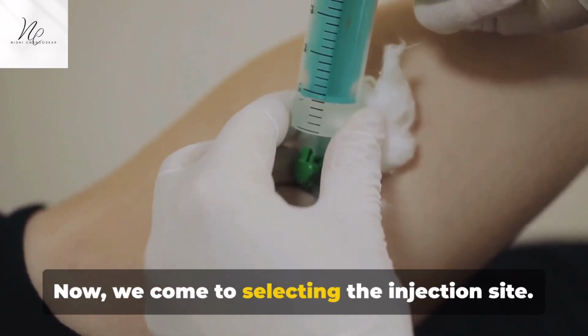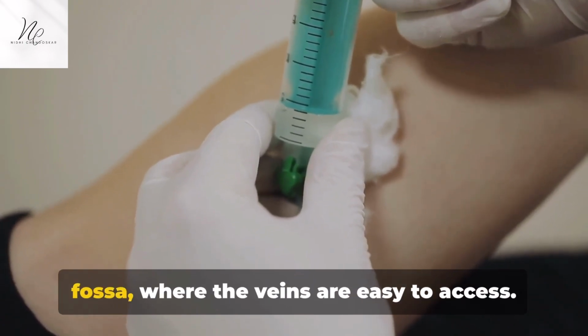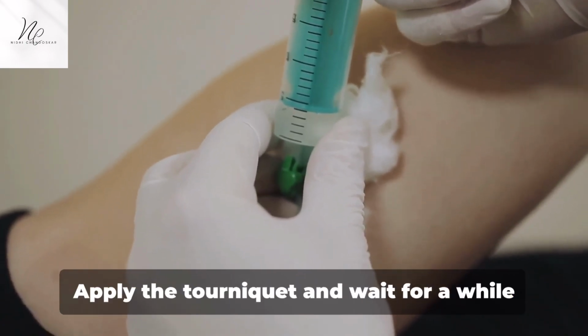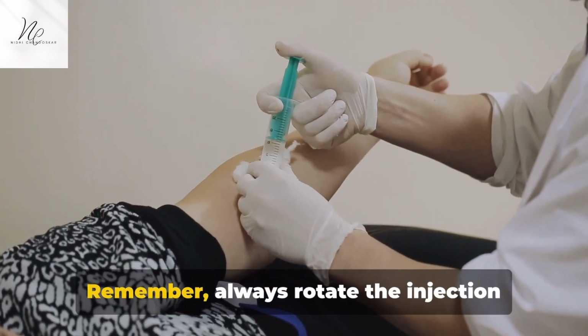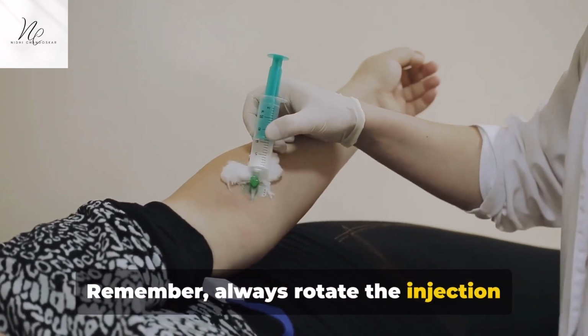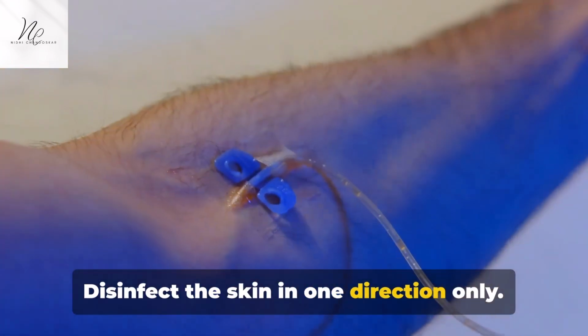Now we come to selecting the injection site. The most common site is the cubital fossa, where the veins are easy to access. Apply the tourniquet and wait for a while for the vein to swell. Remember, always rotate the injection sites to prevent damage to the veins. Disinfect the skin in one direction only.